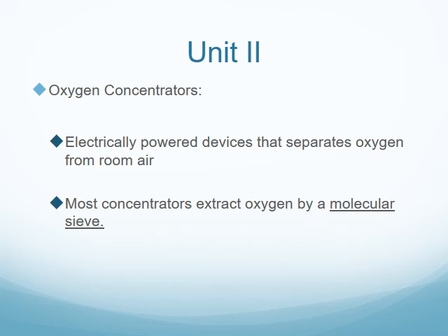So I'm going to talk about that a little bit here. The electrical power devices separate oxygen from room air, so you don't have to have a tank or anything. Most concentrators extract oxygen by a molecular sieve.